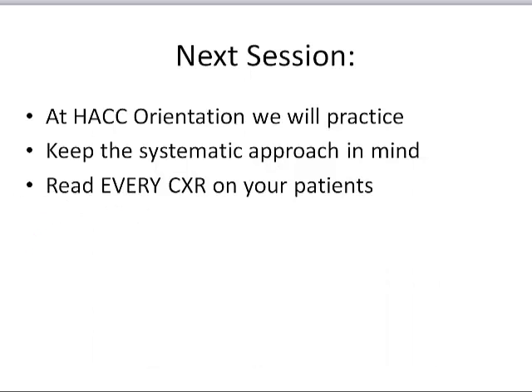That's all that there is to it. As long as you can remember A through F, you'll be a pro at reading chest x-rays in no time. So on Monday, what we're going to do is we'll practice. And as long as you keep the systematic approach in mind, you guys will do great. Always make sure to read every chest x-ray on your patients when you're on the medicine floor, and any other floor for that matter. The only way to get good at this is through practice, practice, practice. So we'll start that process on Monday.